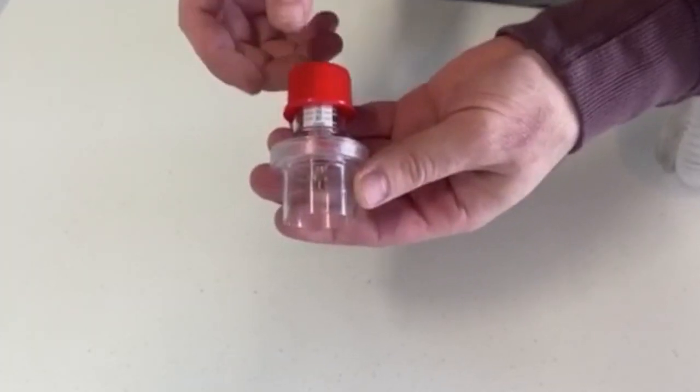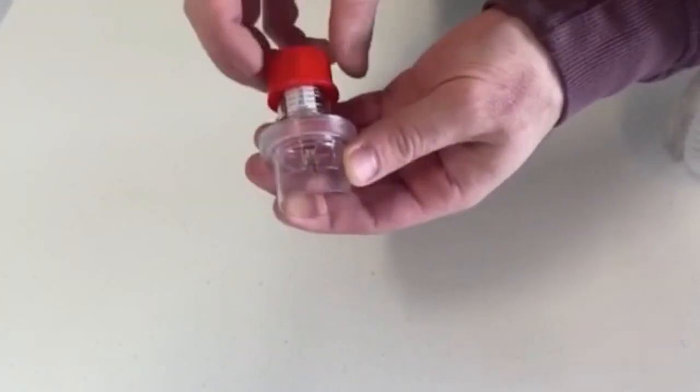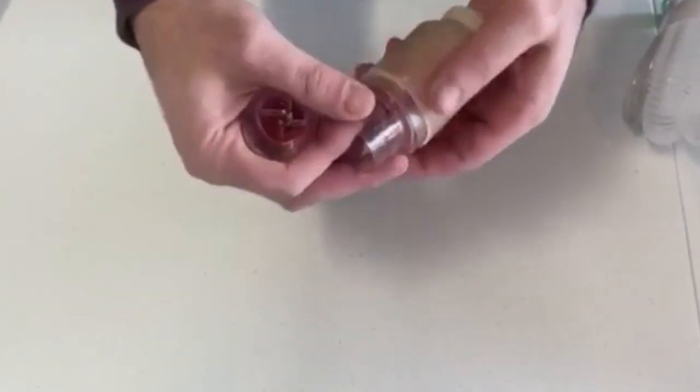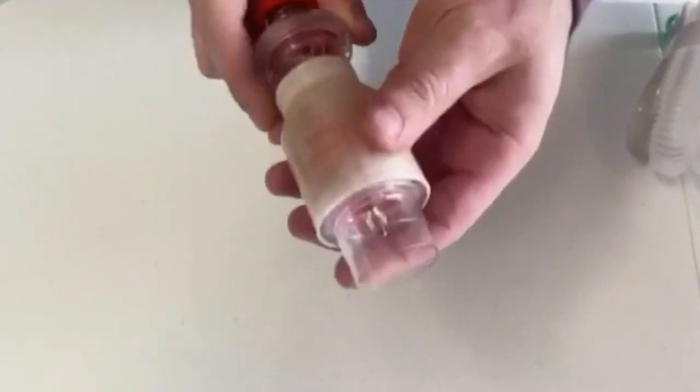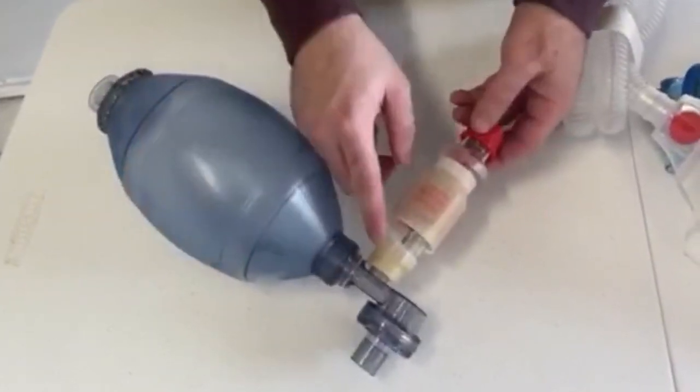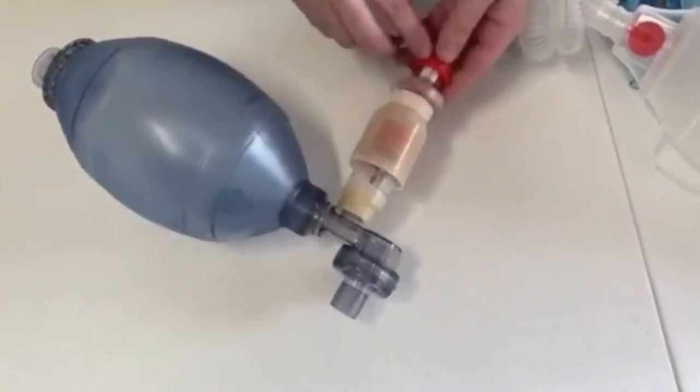This is an Ambu PEEP valve attachment and it goes up to 20 centimeters of water. Take two PEEP valves and stack them one on top of the other. Now the total adjustable pressure relief starts at 20 plus whatever number is here.